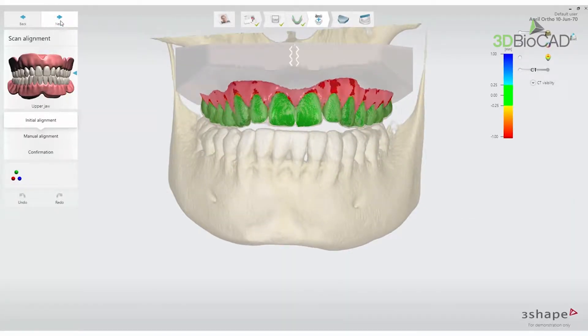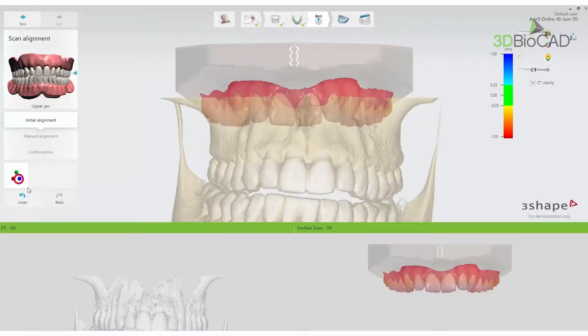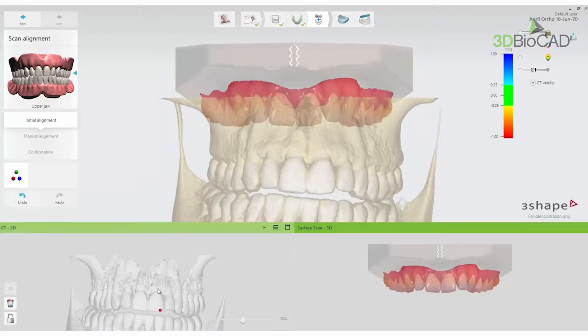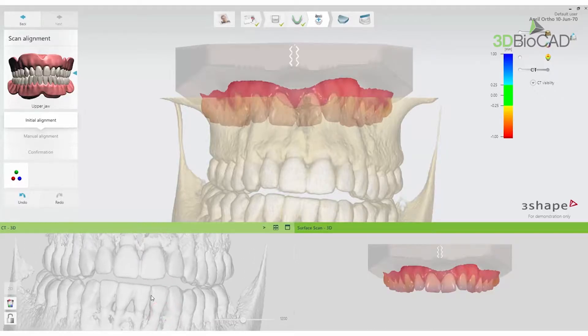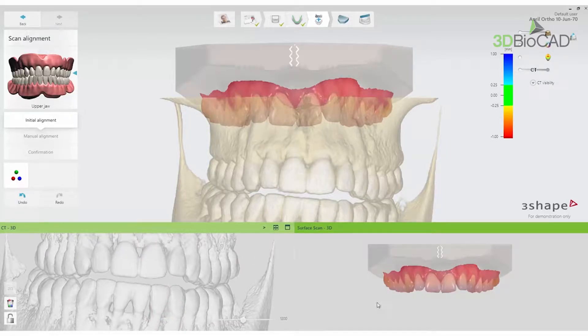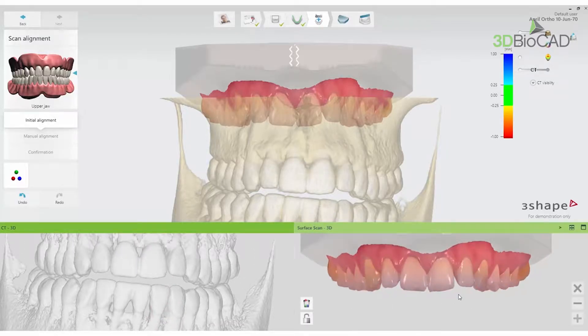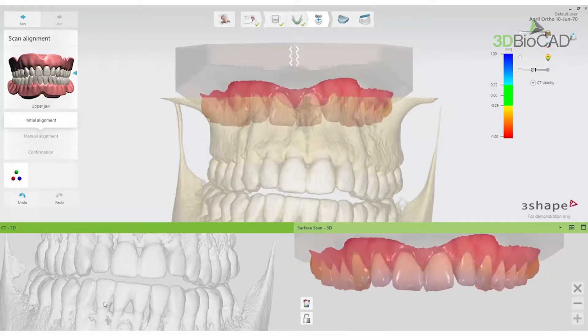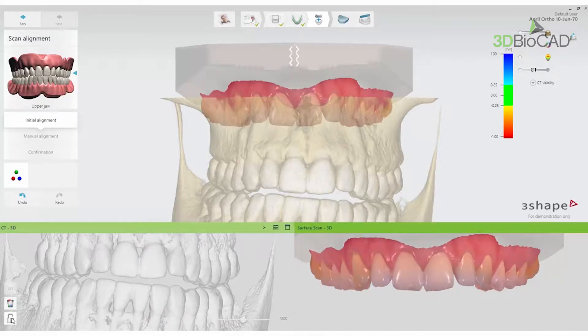Select the three colored dots — red, green, and blue — on the left side of the screen for three-point alignment. You should move the CBCT Scan to the middle of the screen and press Lock. Then both scans will move simultaneously.